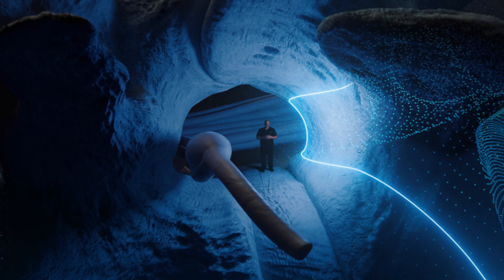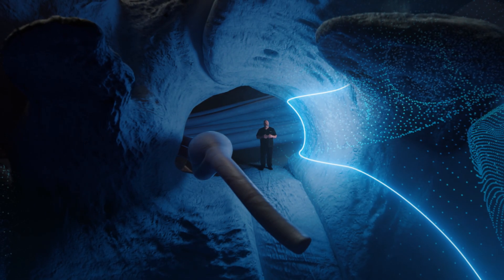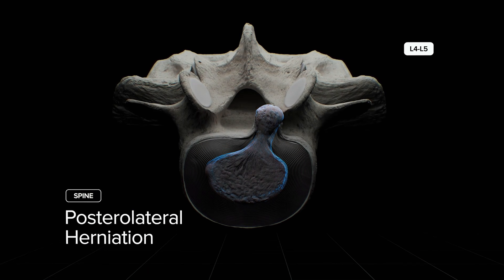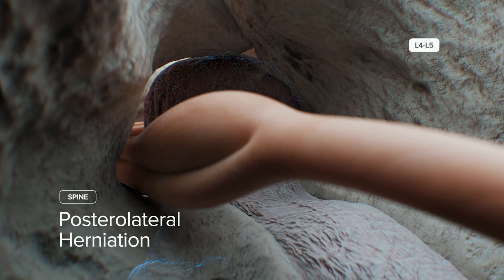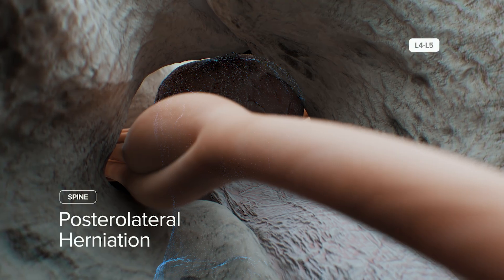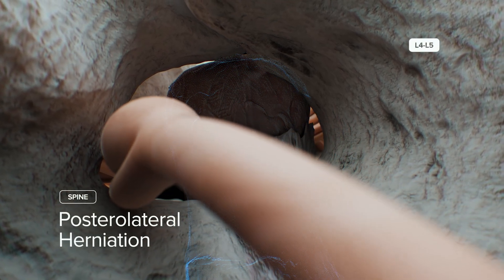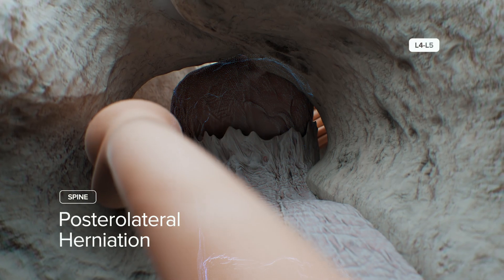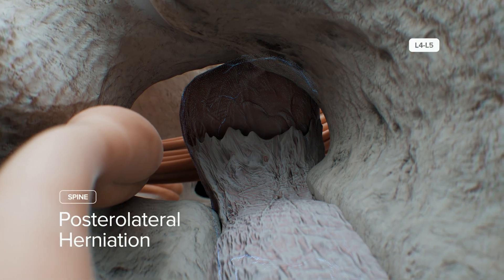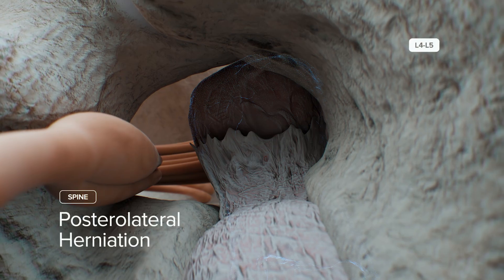Now that you understand how to visualize Kambin's prism through an endoscopic transforaminal approach at L4-5, let's discuss different disc pathologies. Here is a typical contained posterolateral herniation that displaces the traversing root dorsally. Looking up at this herniation from the floor of the foramen allows you to visualize the lateral side of the herniation protruding up from the disc space to the SAP. This is a good beginner case — you'll enter the base of the herniation laterally and remove disc material from under the annulus. This continues until the traversing root drops down to the field of view, pulsates to heartbeat, and is freely mobile.